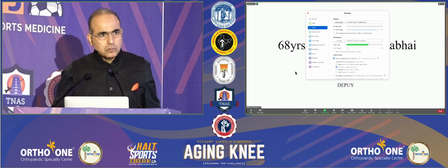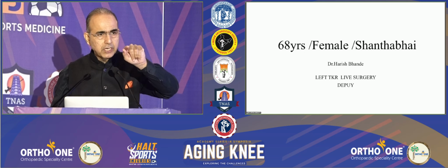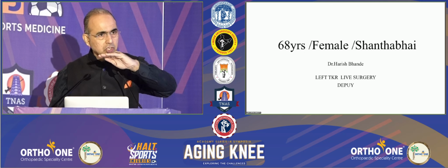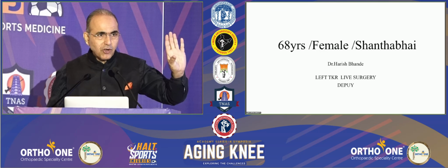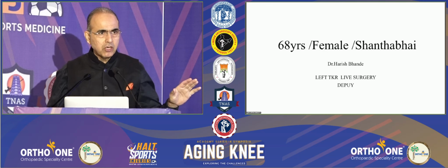So your preoperative scanogram values decide your tibial cut varus, or your intraoperative release, and the robotic assessment gives you your exact varus. No release, just measuring the cut from the robotic arm. We saw that it was 6.5 and 4.1 millimeters on the lateral and medial side respectively, accounting for the bone loss. You can start with 6.5 millimeters and increase 1 or 2 millimeters based on the tightness or laxity of the knee. But the femur is not negotiable, because the center of the axis of the knee passes through the femur. So femur is not negotiable, tibia is.